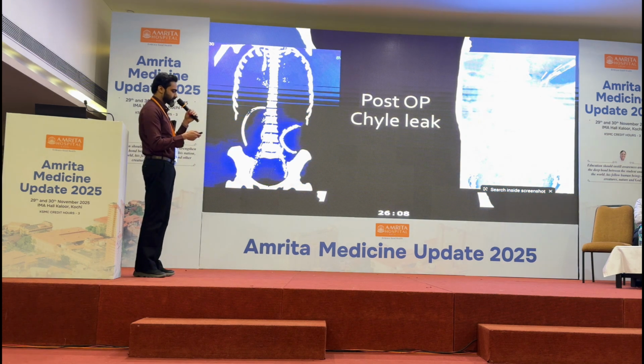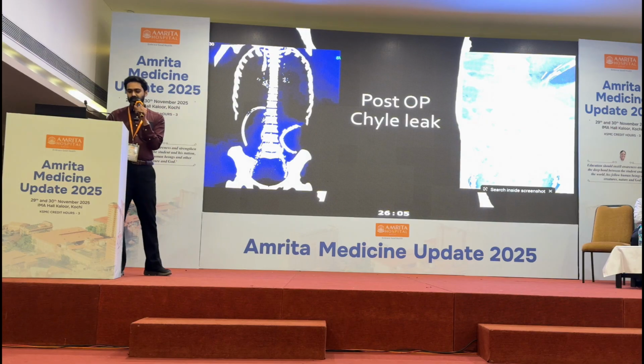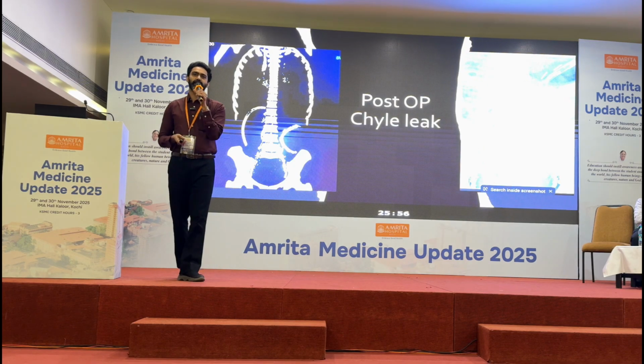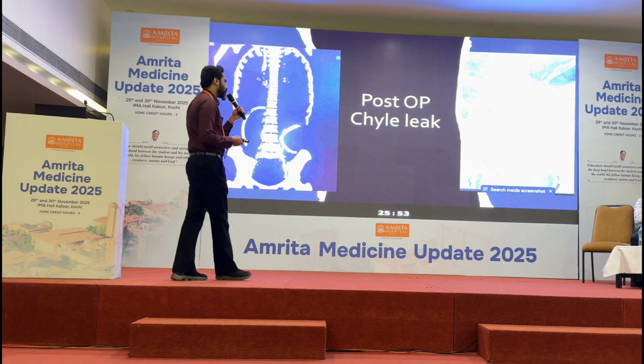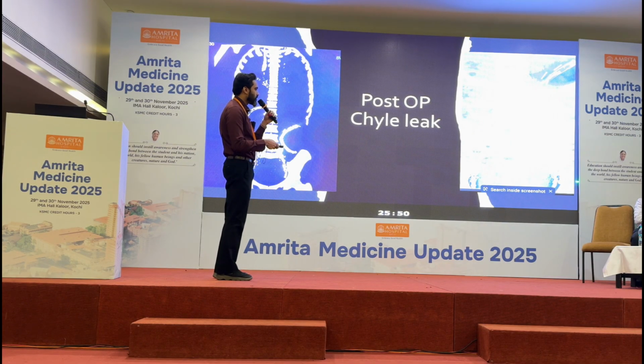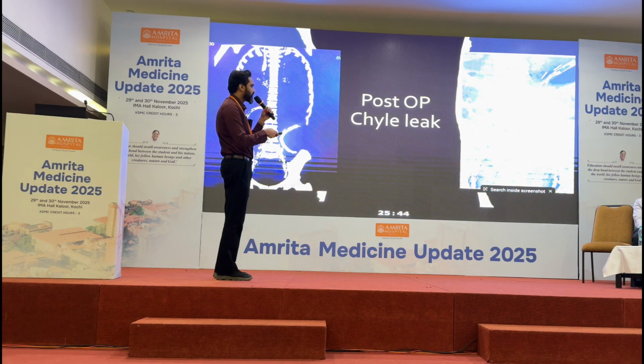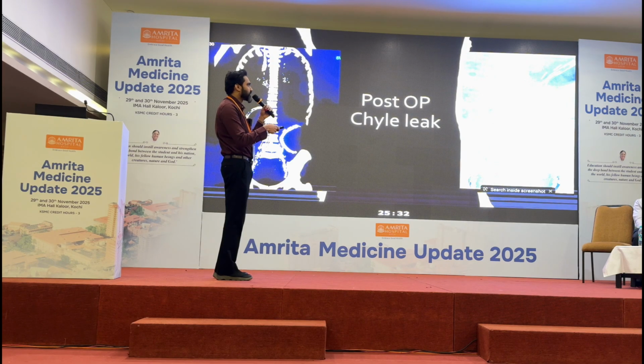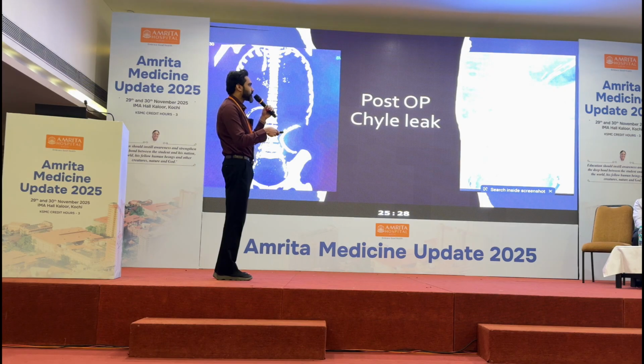So we went ahead, what we did is that we punctured her lymph node in the groin, and then after puncturing, we injected something called lipiodol. It is an ethiodized oil of poppy seed which is used for embolization. It is also a viscous contrast agent, so we injected it into her lymph node bilaterally, and on the right side it is okay. All these white things are the lymphatic channels in the pelvis. On the left side, within half an hour to 1 hour, when the lymphatic channel in the left common iliac station opacified, it slowly started refluxing into her drainage catheter. So then we came to know that yes, this is the point of the leak.